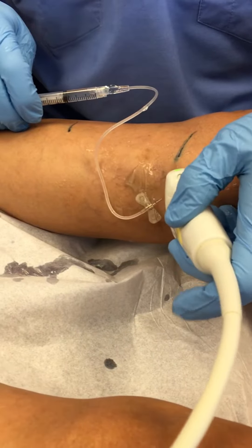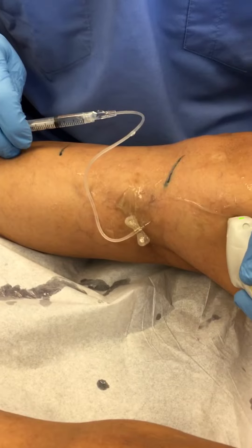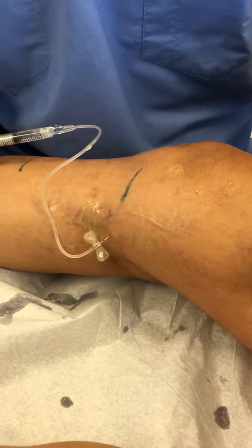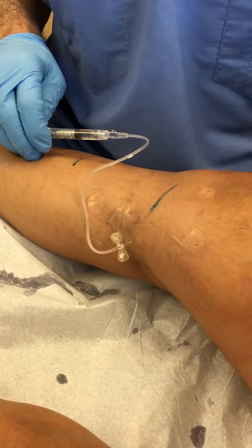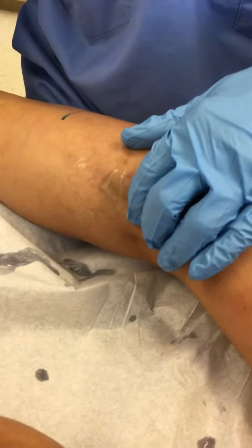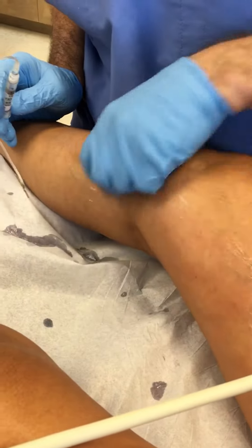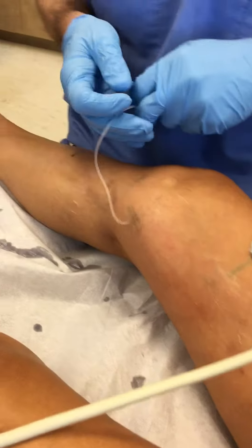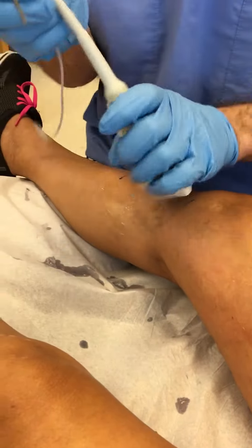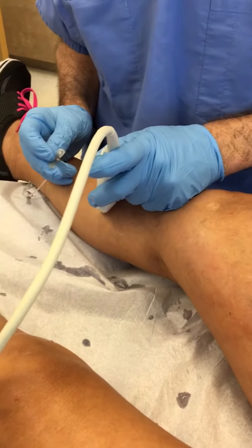So she's doing her best not to moan. She's okay. Are you doing okay? She's fine. She's got the circulation on my hand now — she's holding on tight. She's very lucky. Husbands very rarely ever come with their wives. They'll come maybe the first time, then we never see them. So she has an extraordinary husband, one like we've rarely seen.